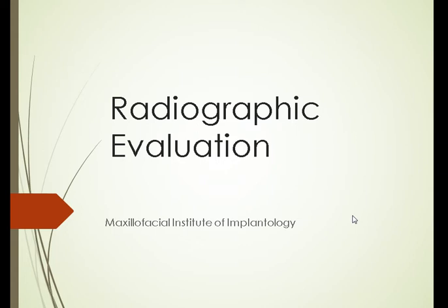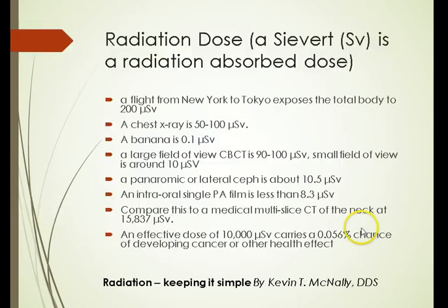And later on, when we talk about anatomy, I want you to also fully understand the concept of cone beam CT scan. So when we start talking about cone beam CT scan, how to read it and how to manipulate it, you can have a nice intellectual conversation with the surgeon if you're referring outside, or if you're obviously doing your own implant.